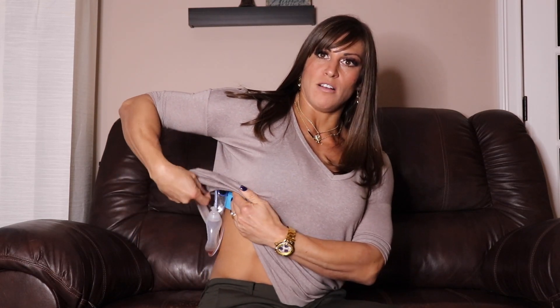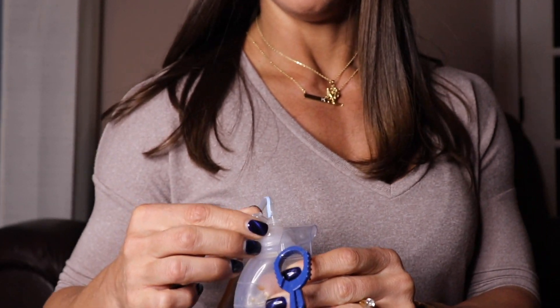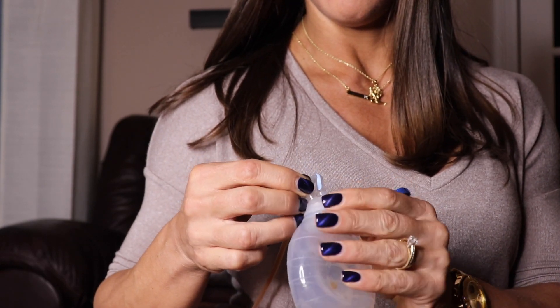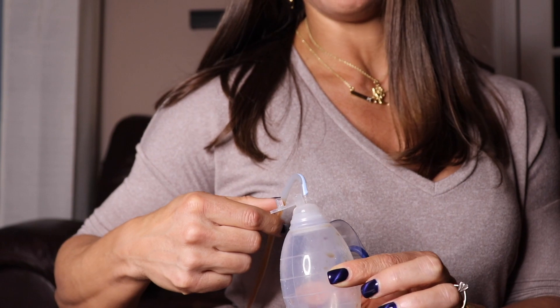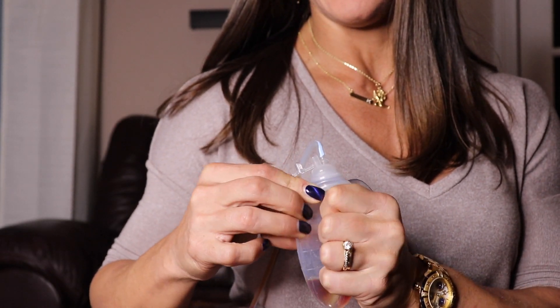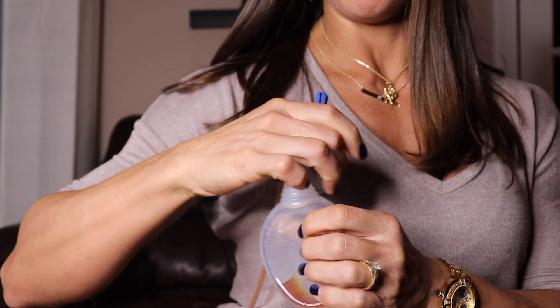I have them clipped to my bra — it's just a little clip. All I have to do is open the clip and then dump it. I can also gently pull on the line to bring out whatever fluid is left. Then I squeeze it nice and tight and reclamp it once it's emptied, and clip it back to my bra. I have a drain on each side — a separate line on each side — so I go through the same process on the opposite side.